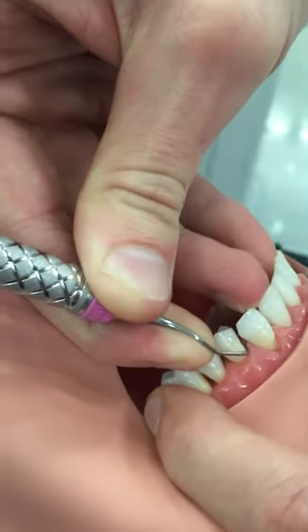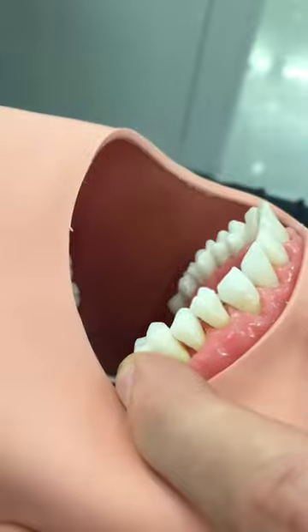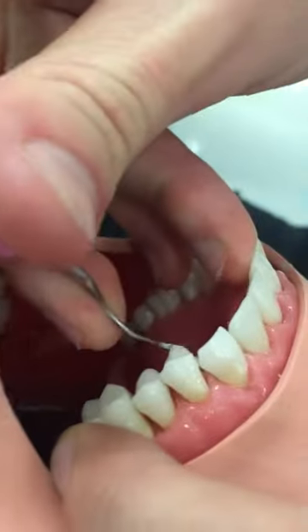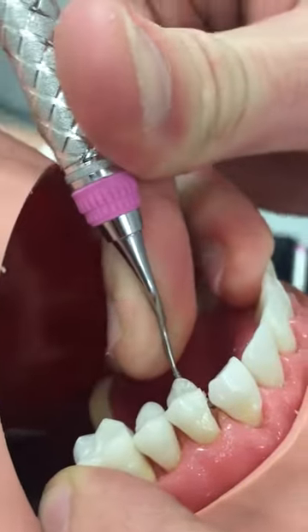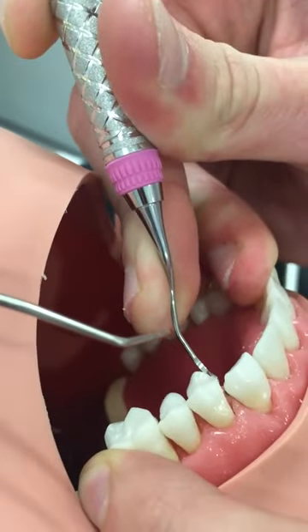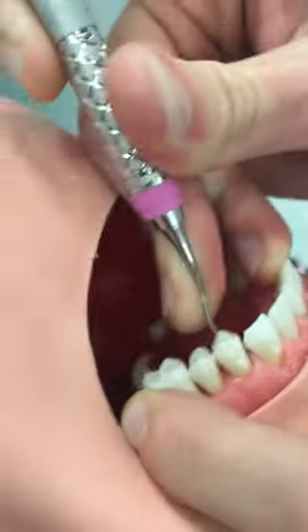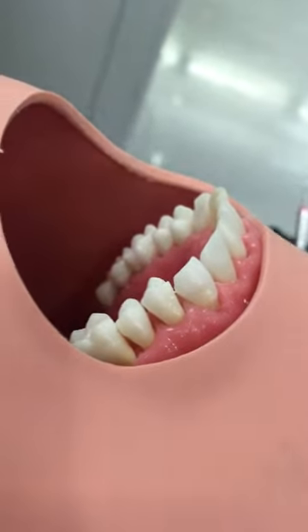Bryson will show you that on the lingual aspect of the tooth. So we're on the buccal now, and when he switches to the lingual aspect, you're going to want to try to put it in at zero degrees. But once you straighten it up to do that working stroke, you'll notice that this again is always pointing to the distal, and that trend is true throughout the entire mouth. He can jump to the distal aspect of the tooth really quick.